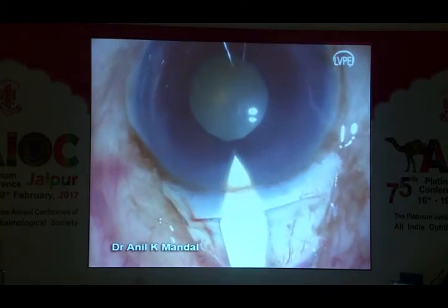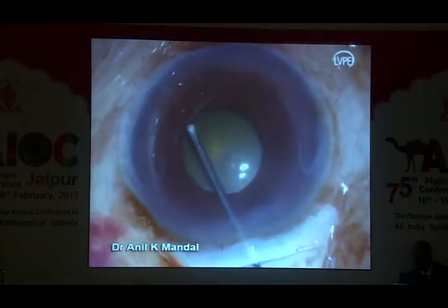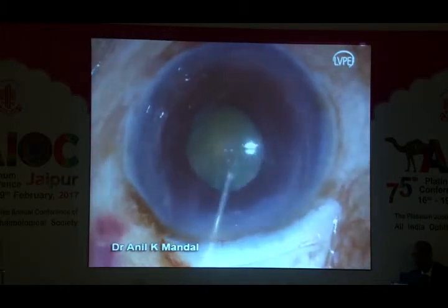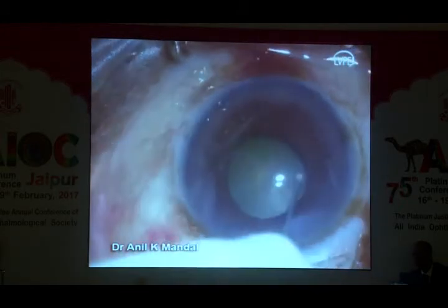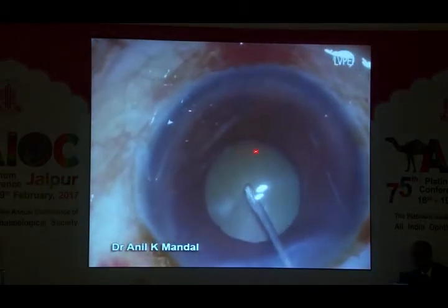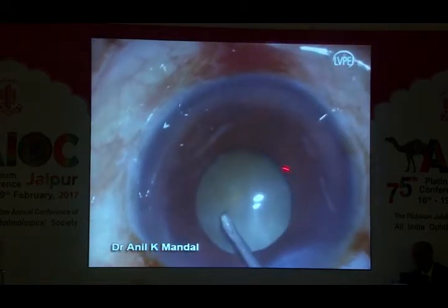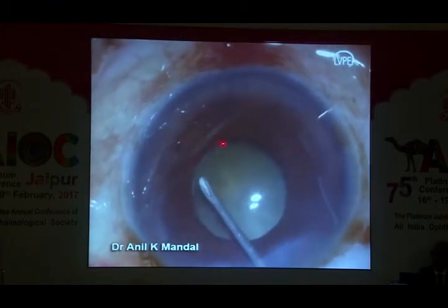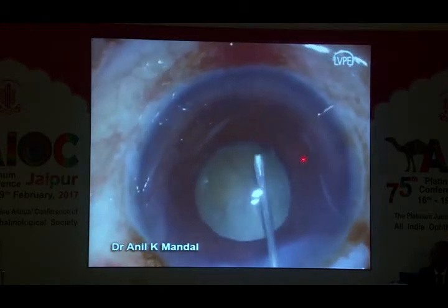and the anterior chamber is entered with the keratome. I am trying to put viscoelastic under the pupillary margin and pushing in some more viscoelastic, because I wanted to create a space between the anterior surface of the lens and the iris so that I'll be able to do a reasonably good rhexis, and for that I want to carry forward the rhexis, which may not be visible to me, and it will be going underneath the iris surface.